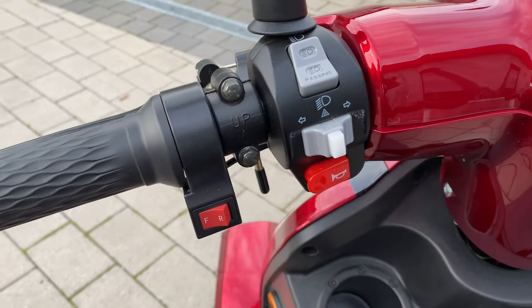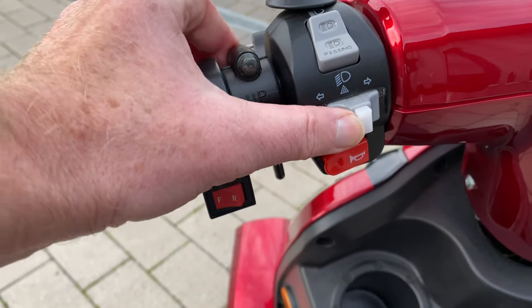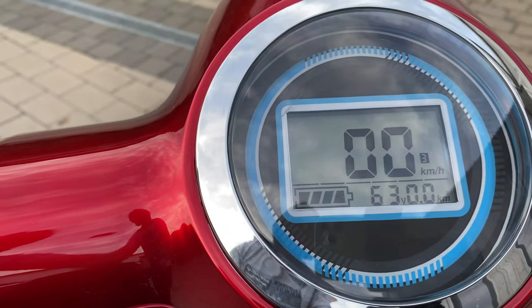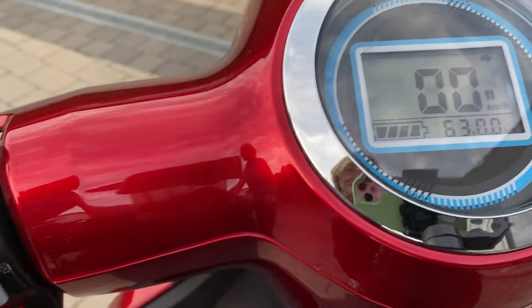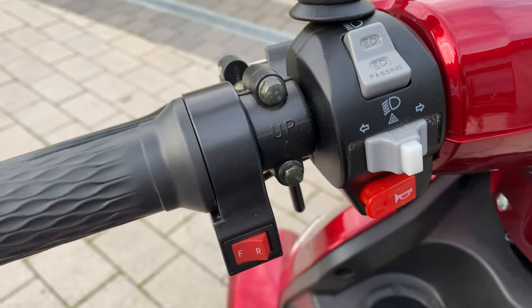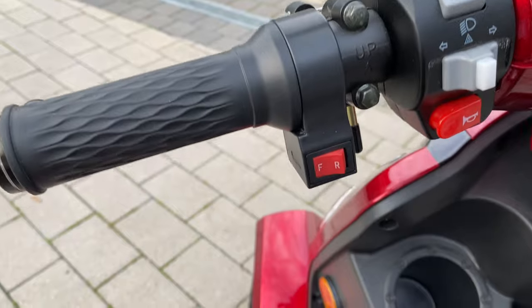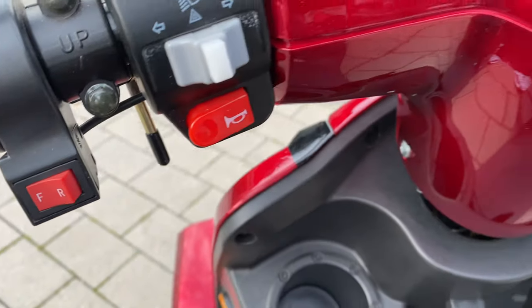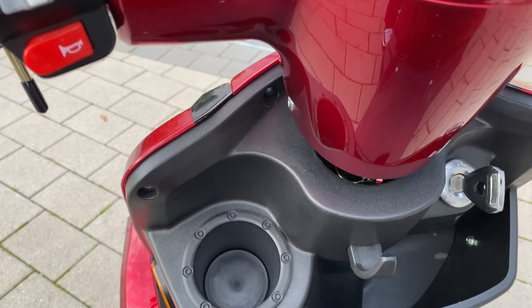The controls on the left can be seen here. This is a turn signal switch including the hazard warning light function. The indicator is switched off simply by pressing the switch in the middle. Above the turn signal switch is a high beam switch including the horn, which is also on the right side. To the left of this is a reverse gear switch.